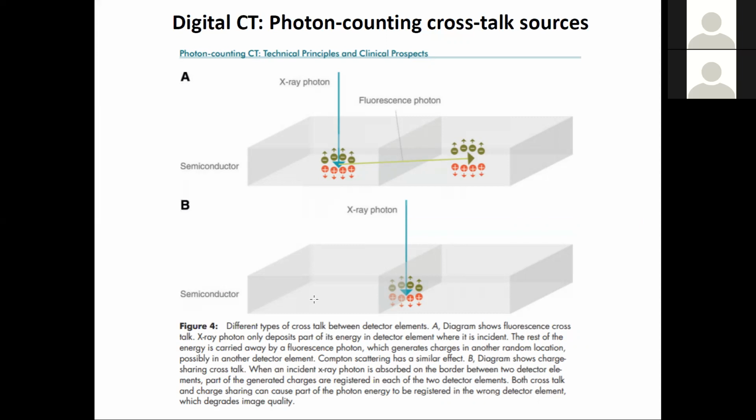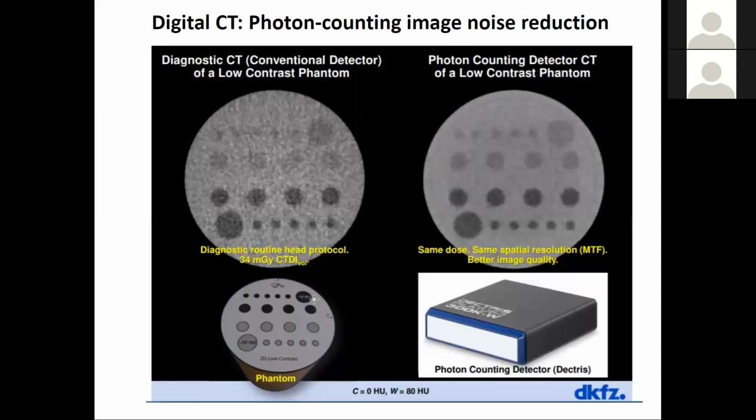Now, could you use a net there? Yes. Have people done that? Yes. Is that new? Yes, this year. So you'll see more development along those lines. The basic thing you're trying to get for your photon counting detector is one of two things. If it's energy sensitive, then you're trying to do some dual energy stuff. If you're not, you can get statistical improvement just from the fact... oh, where's my slide on that? There should be a slide.